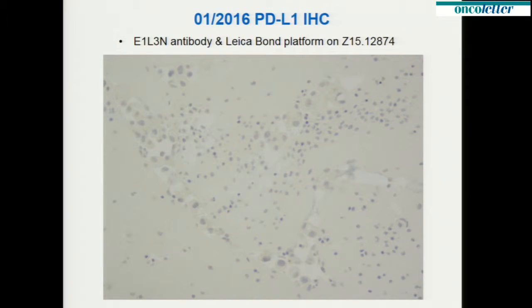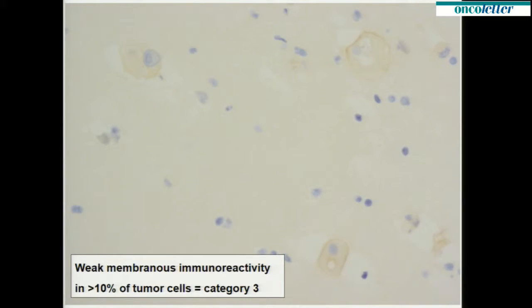And now, as a pathologist, you need to make a report. So what shall I write now in the report? Because it's important, it gives you an idea into which direction to go. Somebody has a judgment? Difficult judgment on this magnification. You may think about, well, here there is some blush of brown, as Keith Kerr in Aberdeen would say. Then what I can do is go closer, and then it looks like this. So certainly some of the adenocarcinoma cells have unequivocal membranous immunoreactivity for PD-L1.